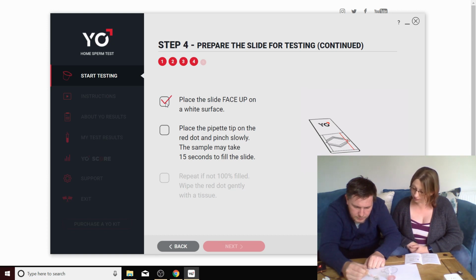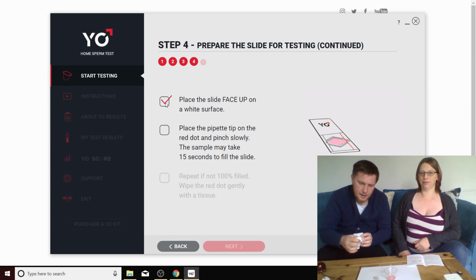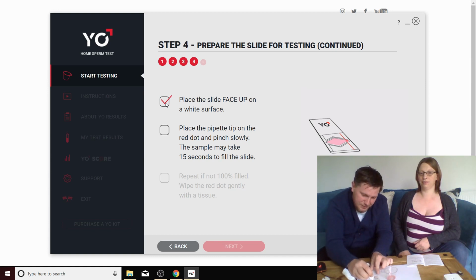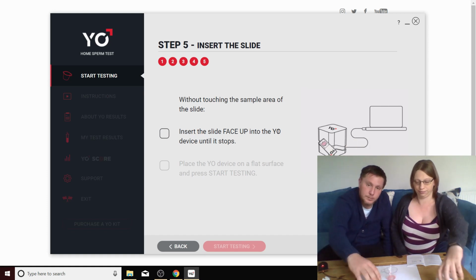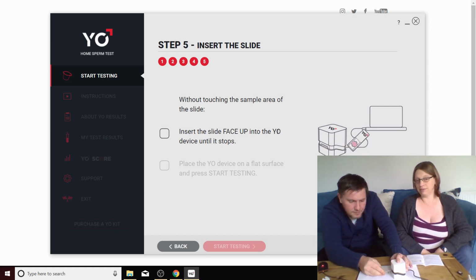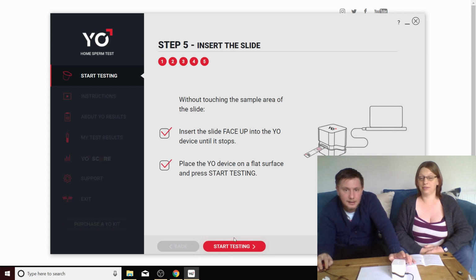There she goes. Okay, so that bit takes a little bit of time for it to start to permeate underneath. Yeah, you can just see like a slight pink tinge kind of running into the slide now. And then it just says wipe, or you can read it. Very gently. Okay, without touching the sample area of the slide, insert the slide face up into the Yo device until it stops. There you go. And it's just stopped. So we take that, press start testing. Yeah, let's do it.